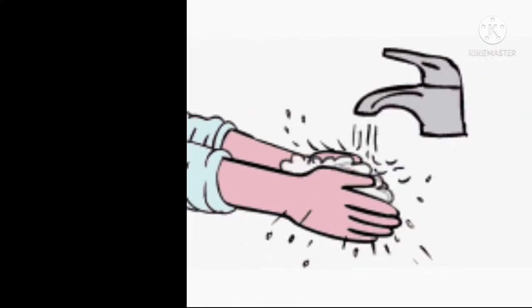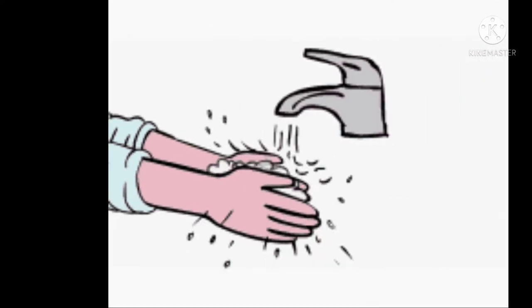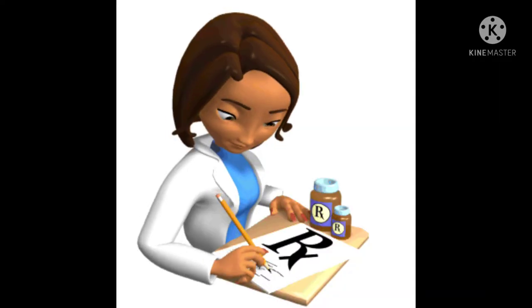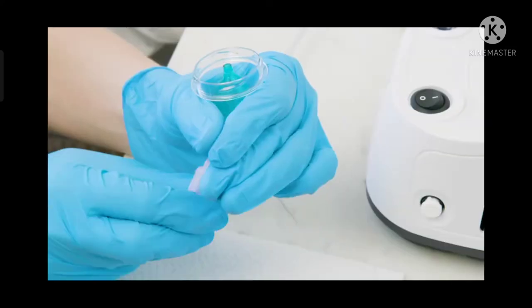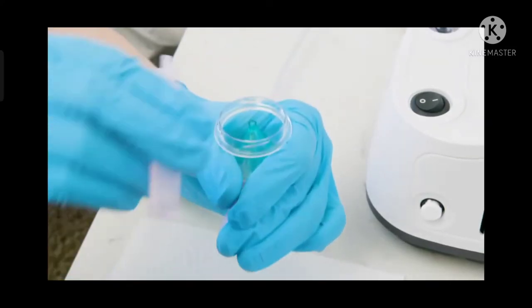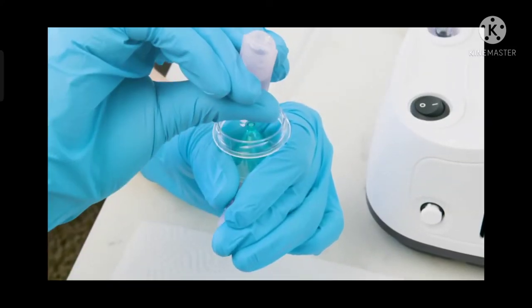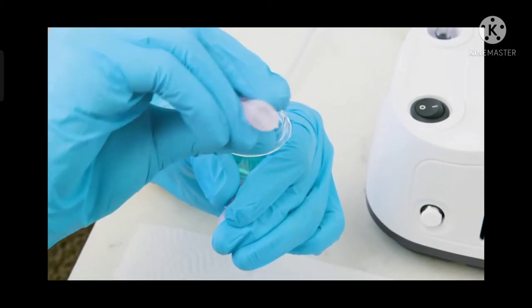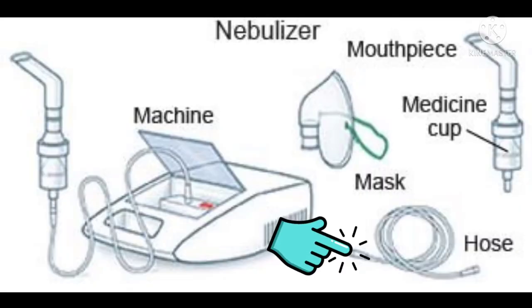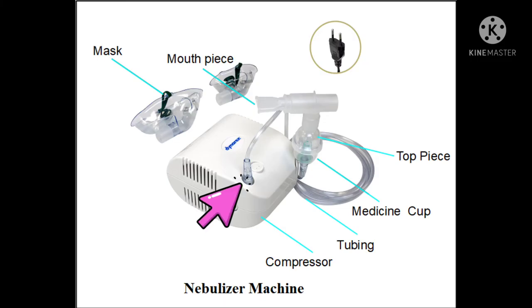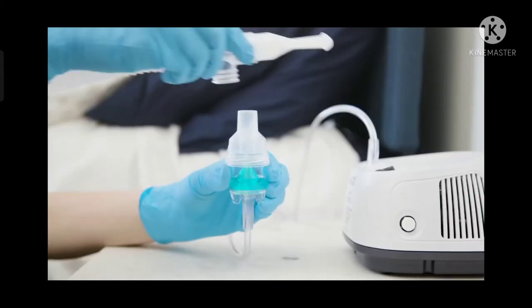First of all, we should wash our hands thoroughly. After washing the hands, we should take the medicine prescribed by the doctor and place it in the nebulizer chamber or nebulizer cup. After that, we should take the hose or tubing, which has two ends — one end should be connected to the compressor.